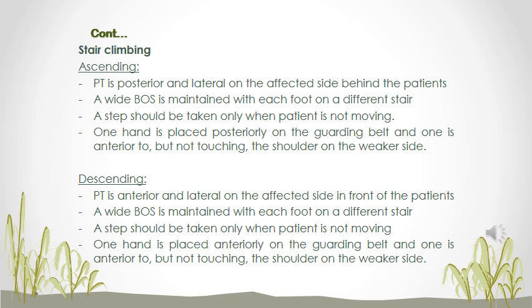So here I'm going to talk about where you will stand while they are climbing stairs. When you go up, ascending, you will be standing posteriorly, behind your patient and to the side of the injured side. A wide base of support is maintained with each foot on a different stair. So that is where one foot will be on a different step to the other one, so that you can maintain a wide base.